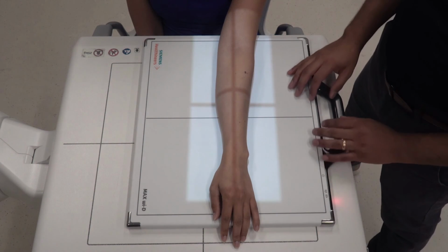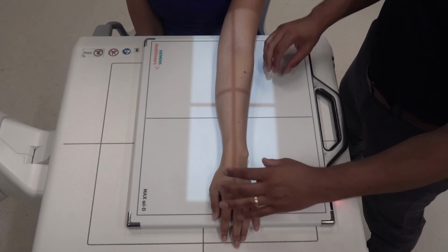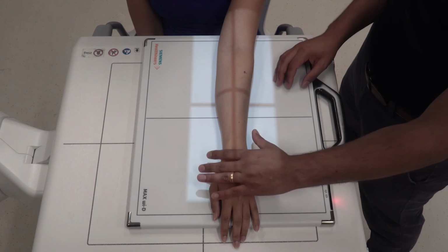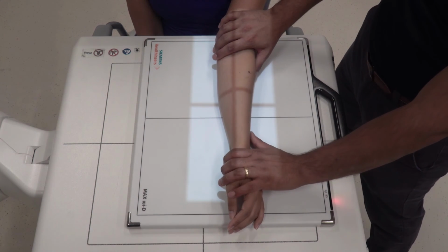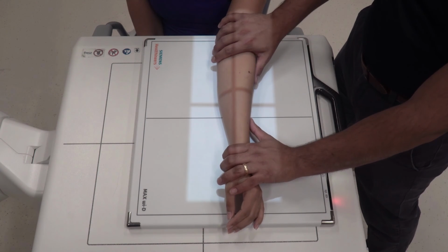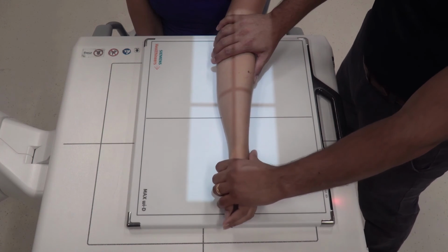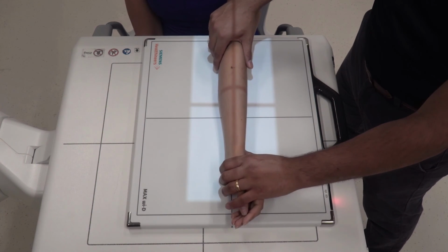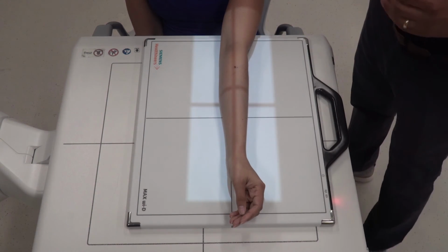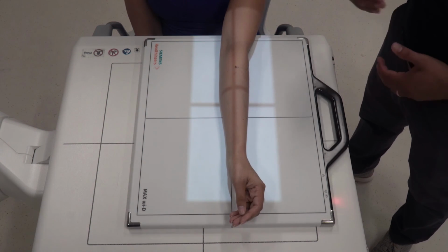When positioning for a forearm, a lot of the patients come in and this is a natural position that they want to be in. But it's important that you place one hand on the wrist, one hand on the elbow. This allows you to have as much movement of the forearm as possible, and also allows you to support the fracture. And this gives the patient a little bit of comfort. Supinate the wrist about 5 degrees, internally rotate the elbow, and that gives you the radius and ulna superimposed on top of each other. So when you go to make measurements and check alignment, you'll have a much easier time.